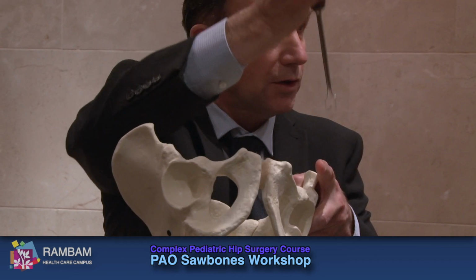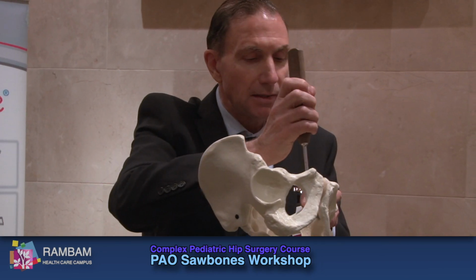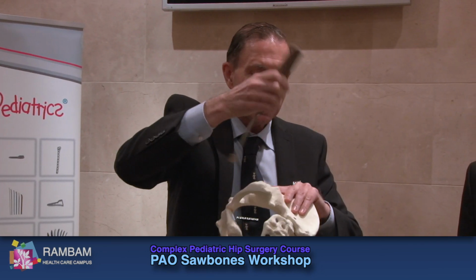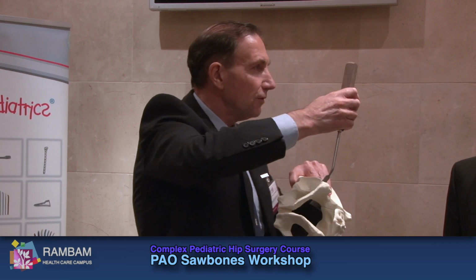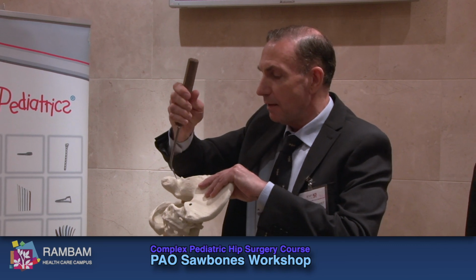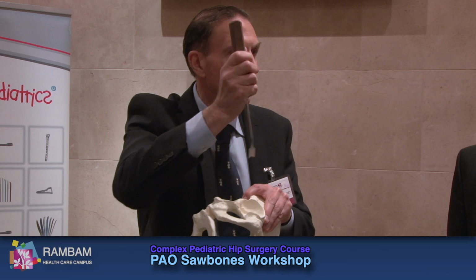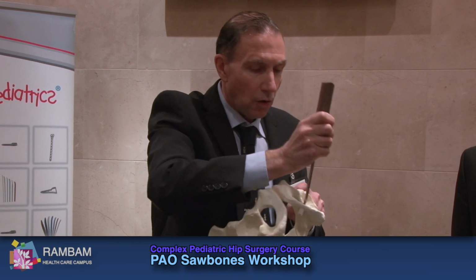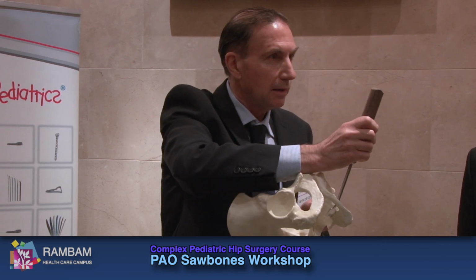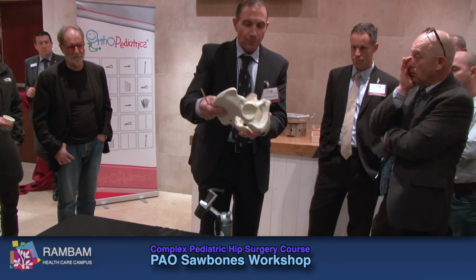As you work on that osteotome, keep working it, bring it out, keep working it, bring it out. Because this makes it easy. This is the commonest sticking point for this rotation, this osteotomy. If you're struggling to get this unhitched and rotated, that's where it's sticking. So really work on this osteotomy to make sure you've got the complete osteotomy halfway through towards the ischial spine. Okay? Then we'll be in this position.